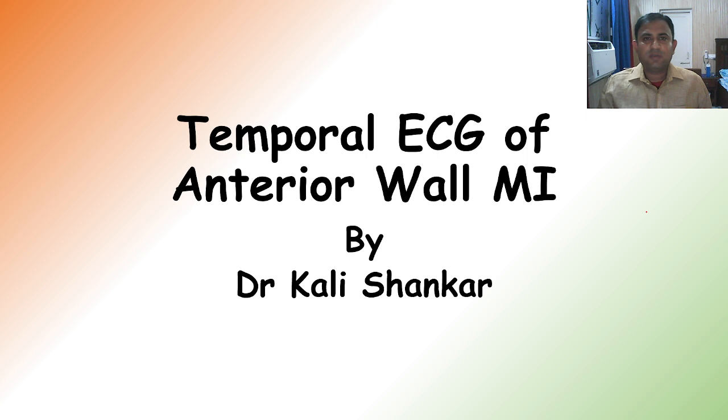Today I'll be discussing temporal ECGs in an anterior wall MI. So, recently that we managed in our hospital, and our hospital is not a PCI capable hospital. So many of you very soon will go to rural postings where sometimes PCI is not available next door. So what do you do जब आप लोग ऐसे दुविधा में पड़ जाते हो? So over the period of next few slides, I will discuss how to manage an anterior wall MI.